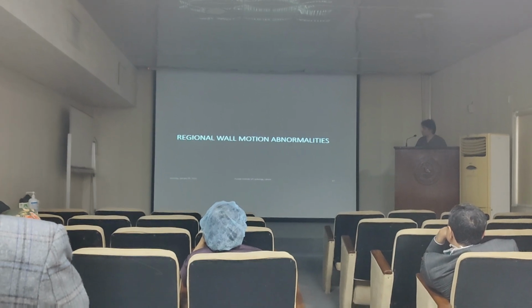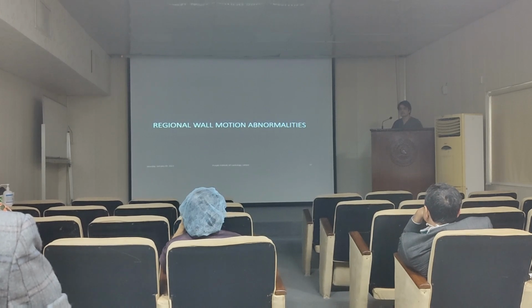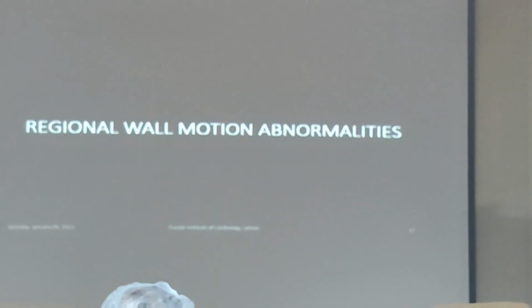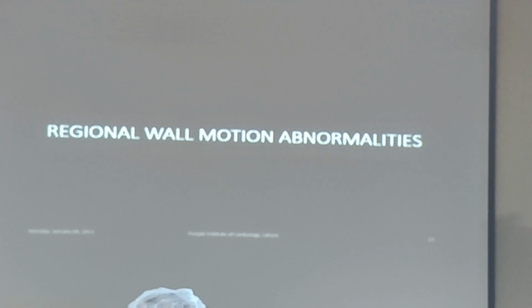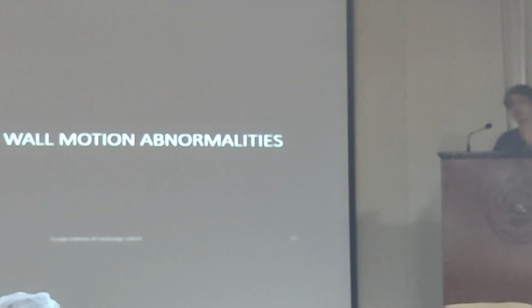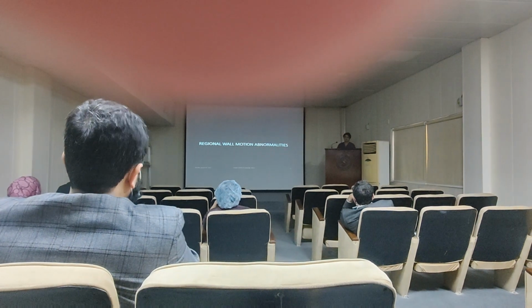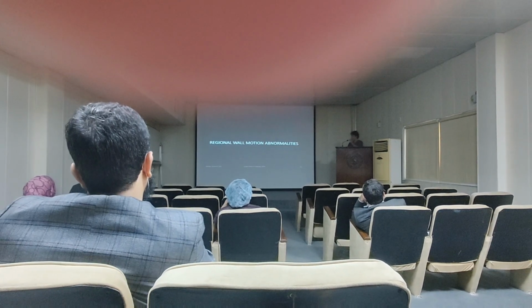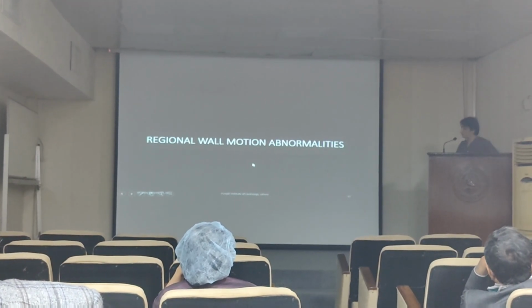This is a very crucial topic for us as we do coronary surgeries. So it is important to look for which region has been involved. The echo will tell us about the ischemia even before the ECG, because the moment the myocardium has been insulted, it will show a motion abnormality. It can tell us before the ECG, and before the cardiac markers. So it is a very good tool, and I find it very interesting and very important. This is why I put it here.